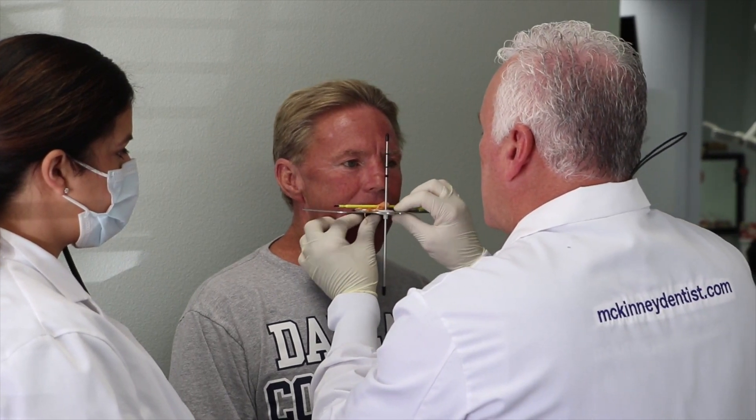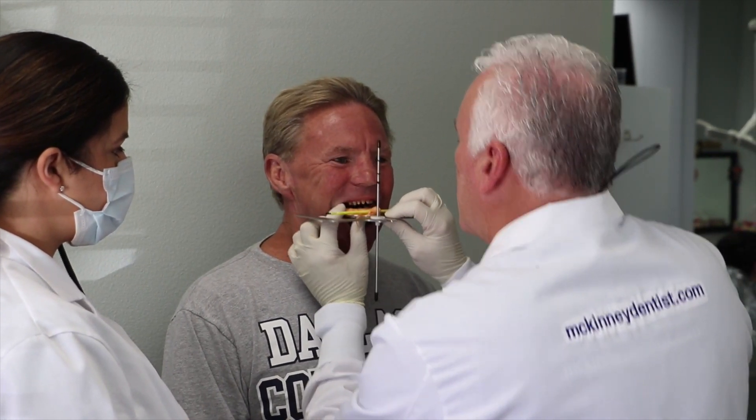I'm going to peel this out. Nice — and we got it.